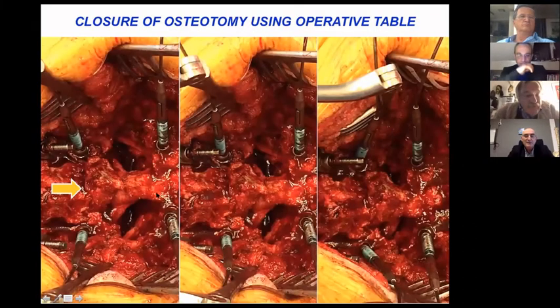So here are the 3 steps. This patient was operated with the table motion. So the opening here, partial closure, you see that the dura is flexing a little bit, and the final closure, bone to bone. So this is the best way to avoid pseudarthrosis after.